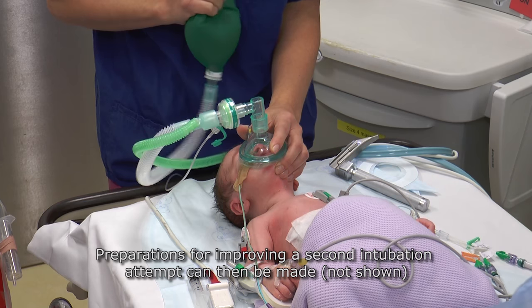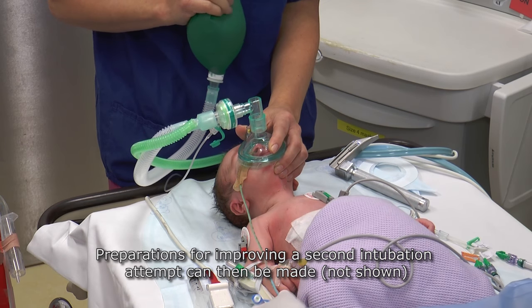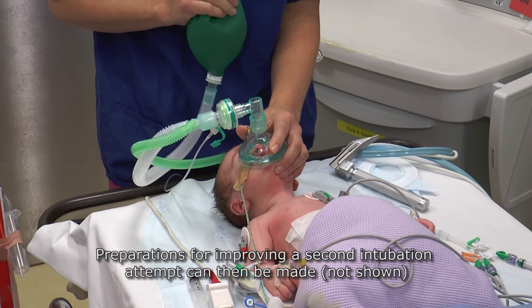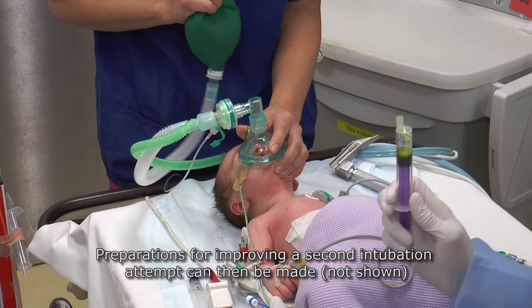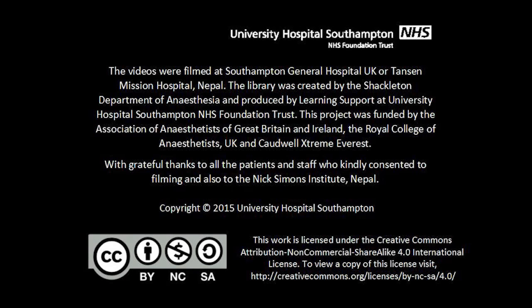Preparations for improving a second intubation attempt can then be made. If there is no hypoxia, a second intubation attempt can be made.